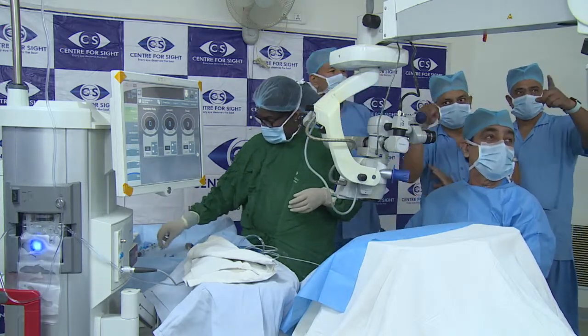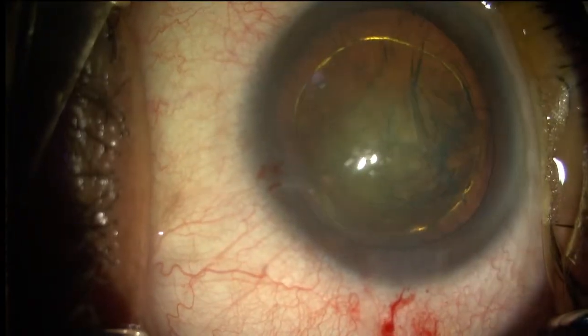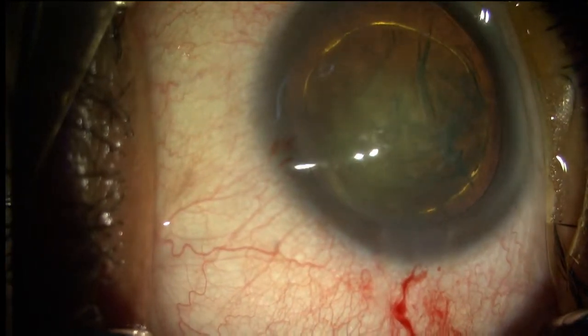Yeah, put this surgery on. I already did the capsulorhexis and hydroprocedure. So we are going to use the Signature Pro machine.